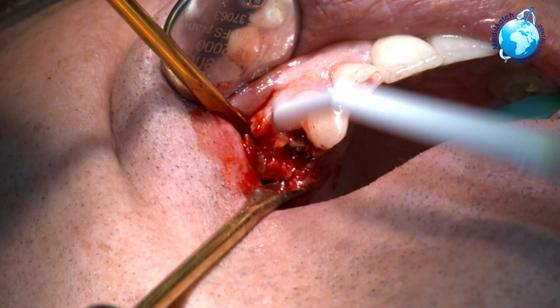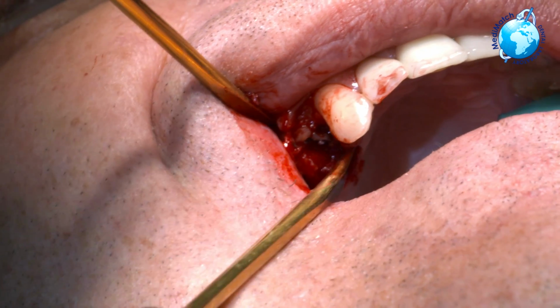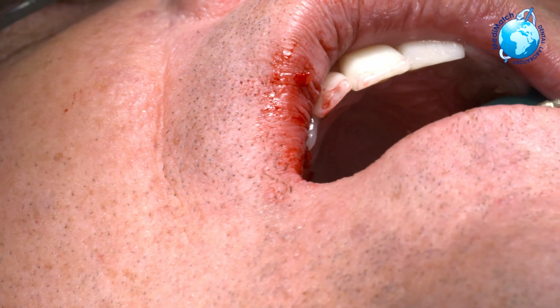Right, so I might need a fast handpiece at this stage. Okay, so we have a premolar that's breaking now, so we need to divide the tooth up a little bit.